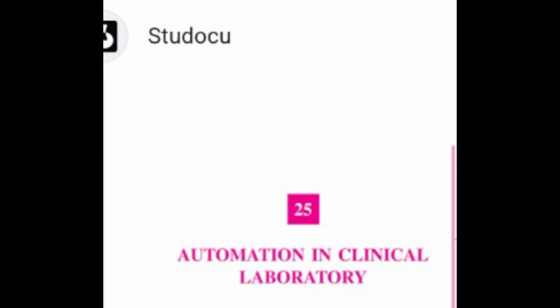Specimen preparation: the clotting of blood, centrifugation and transfer of serum cause delay in specimen preparation. To eliminate these problems, whole blood can be used for analysis, so automation of specimen preparation can be done. Specimen handling, transport, delivery: in most cases, the specimen presented to an automated analyzer is serum. All cups or tubes containing the solution for analysis should be covered if the assay is delayed. This is to prevent the evaporation of the sample.